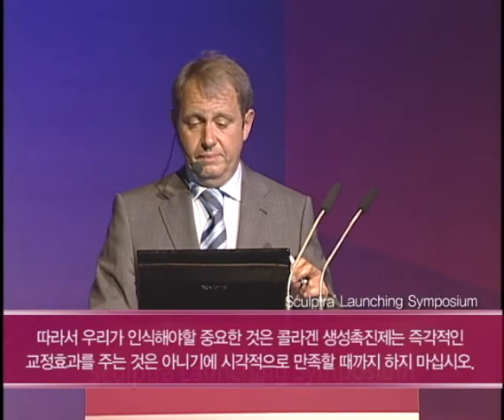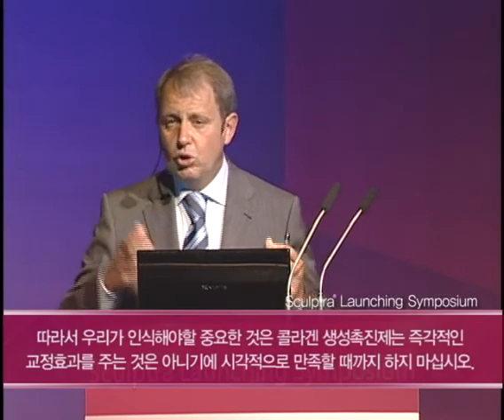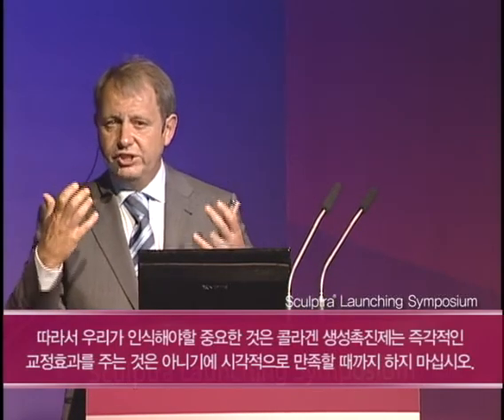So, crucial to realize, collagen stimulation is not immediate filling, not immediate correction. Never overcorrect. Don't go on till you have a visual satisfaction, because that's what you do with dermal fillers. You get what you see.